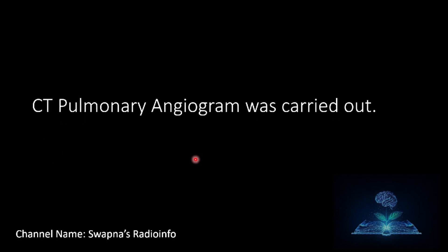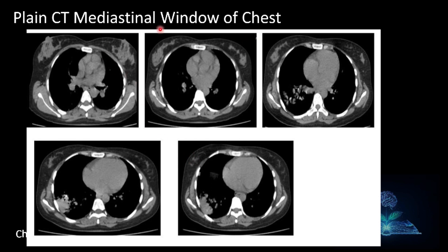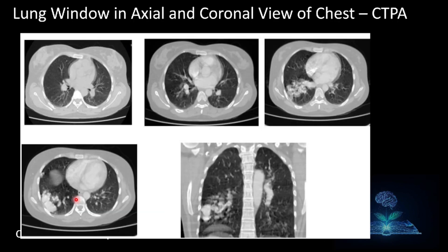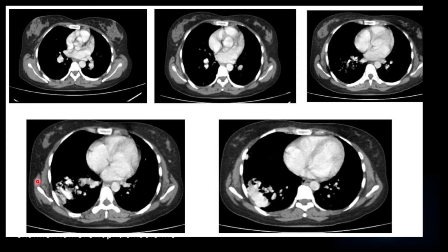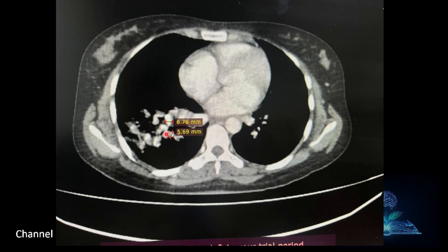CT pulmonary angiogram was then carried out. The plain CT in the mediastinal window shows soft tissue opacity in the right lower lobe in a subpleural location. The lung window in both axial and coronal views clearly shows the lesion. On CT pulmonary angiogram, an intensely enhancing vascular nidus is seen in the right lower lobe, along with the dilated inferior pulmonary vein and two arterial feeders measuring 6 mm and 5 mm.